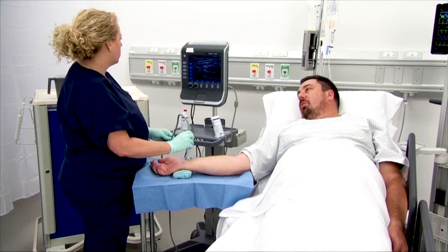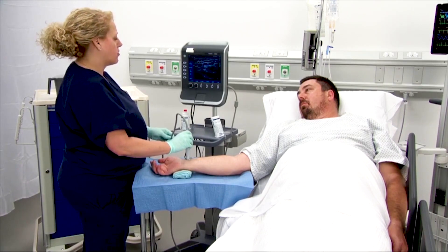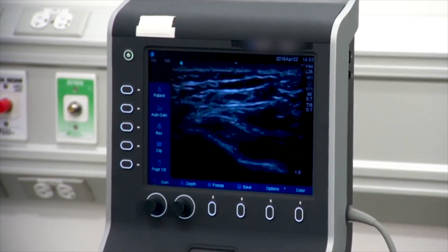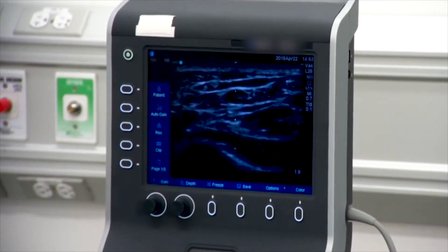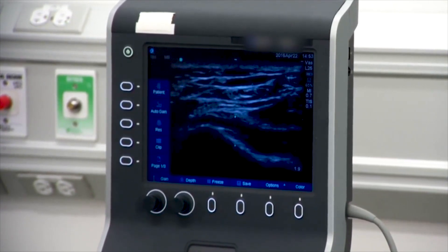Perform a vessel assessment using ultrasound. Using the ultrasound probe, assess the intended insertion location for the optimal insertion site. Assessment should include the vascular anatomy, vessel depth, and nerve pathways that may inhibit a successful insertion.